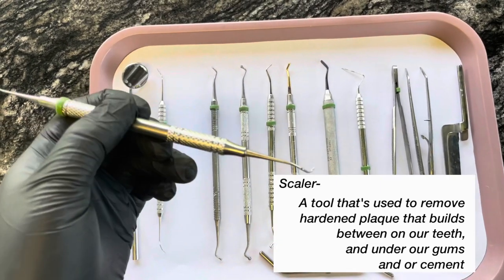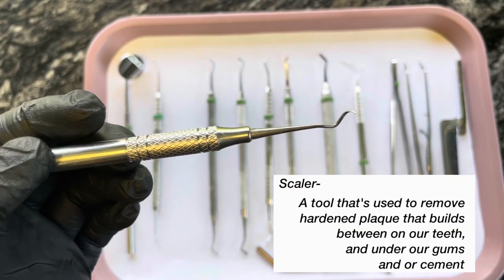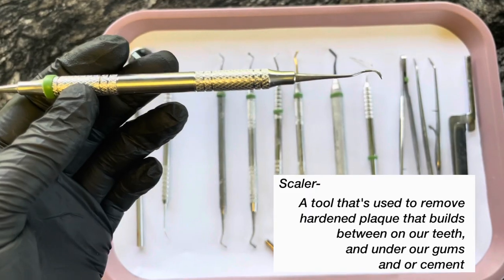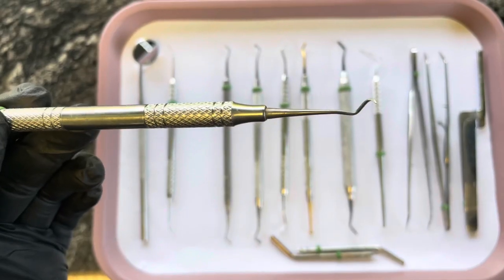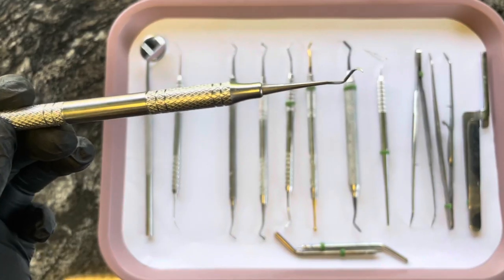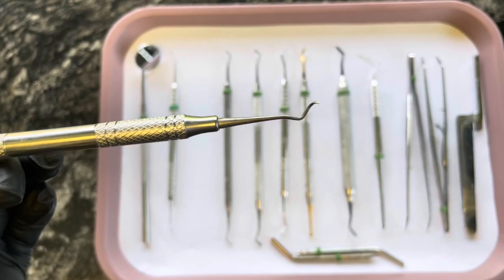Next one is a scaler. It kind of looks like an explorer, but it's a little bit thicker. It is still pointy, but just a little thicker. And this is used to clean off any cement, any buildup — we mostly use it to clean off cement or anything like that. Hygienists use scalers as well, but they have a bunch of different scalers. I don't know the technical name for this one, but it's just a scaler to us.